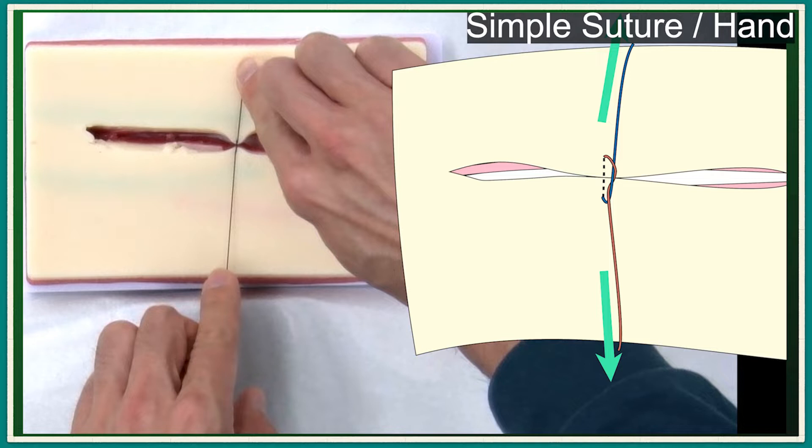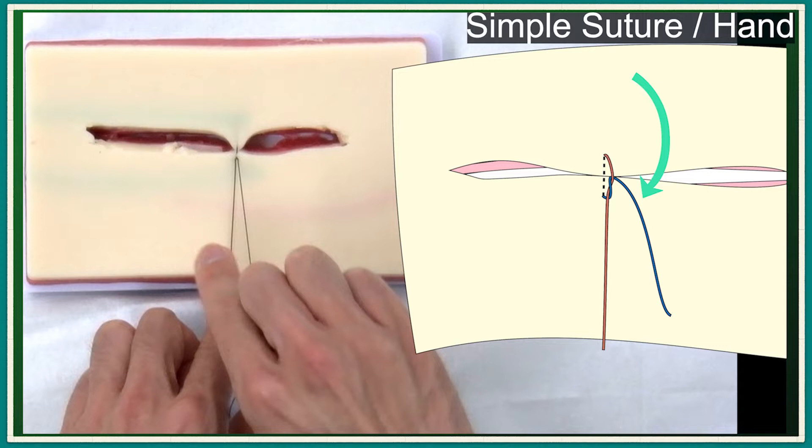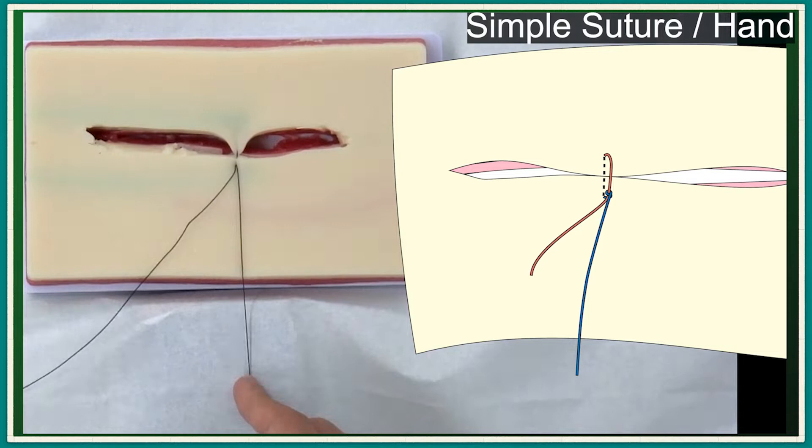Pulling both ends of the suture in one line approximates the skin and increases the suture tension. Once the suture tension is decided, with pulling the left hand, bring the right hand back and pull it downward, and the tied knot is locked by friction. After you release the left hand, the suture tension will be held.